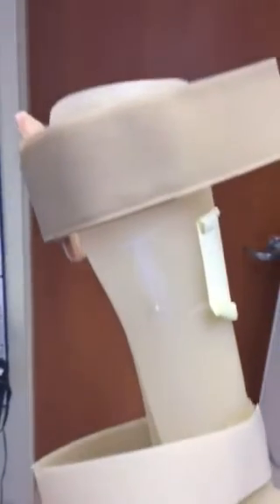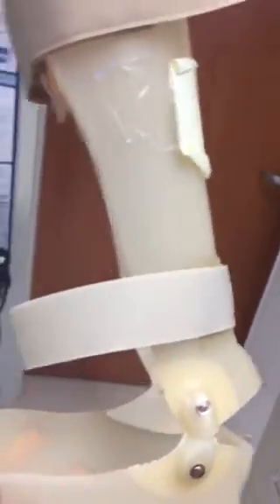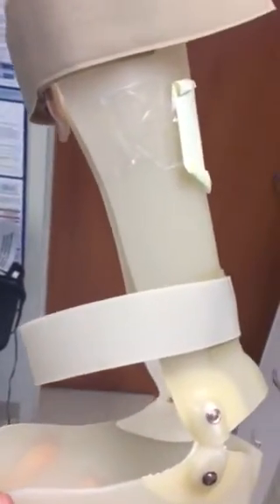So what does that do? Well, as you can see, if you can imagine, above the top of this AFO would be someone's knee. So the joint would allow the person to bend down if they needed to.